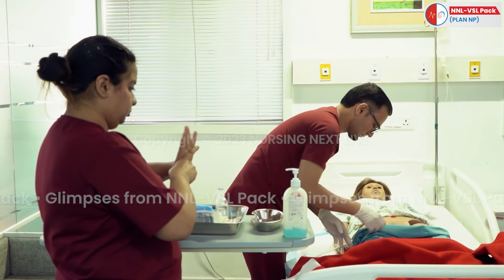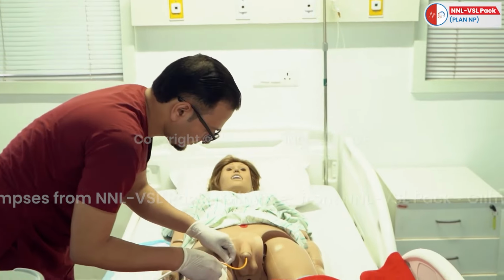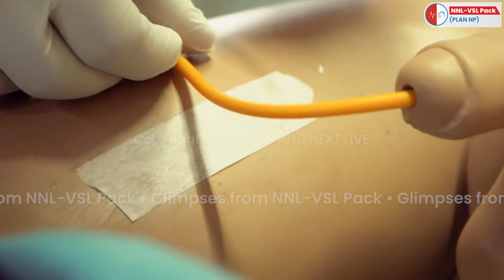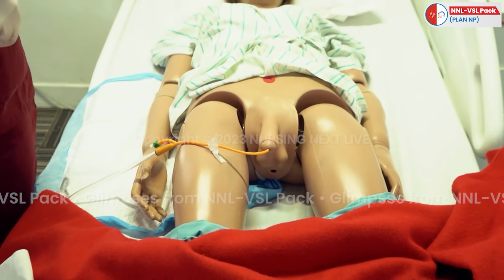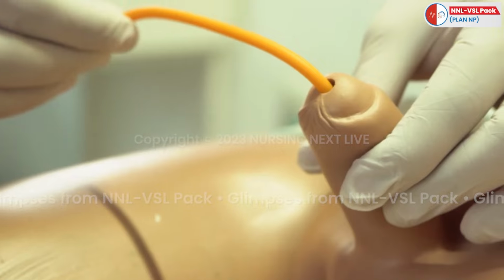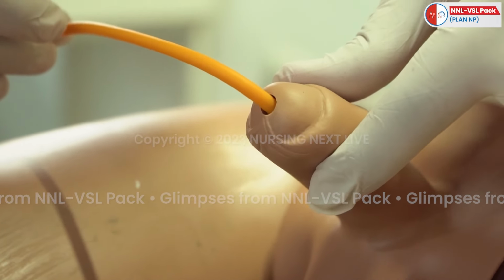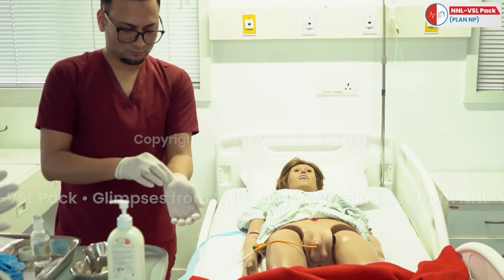Remove the anchor tape to free the catheter tubing and inspect the area for any kind of infection or inflammation. Remove old gloves.